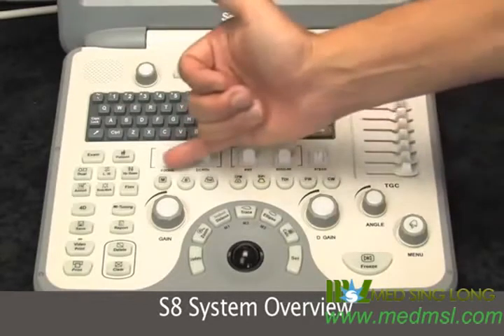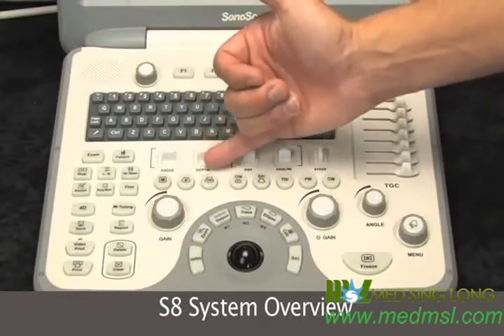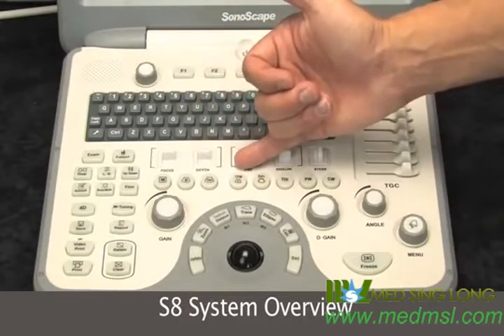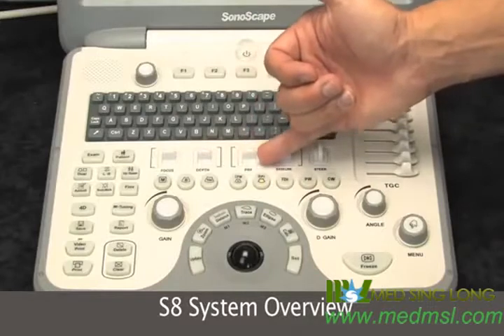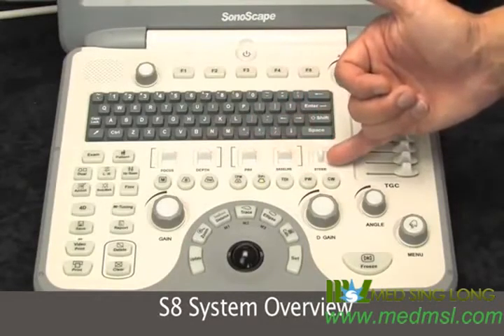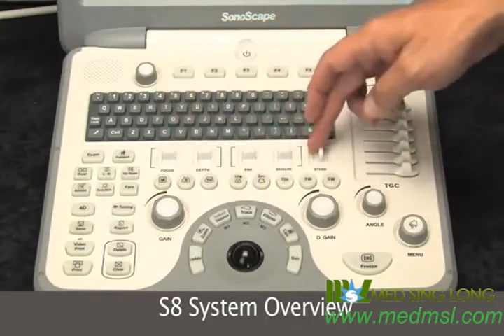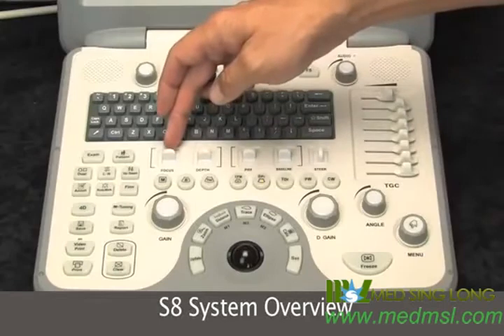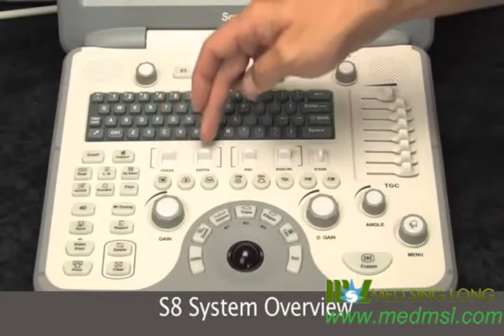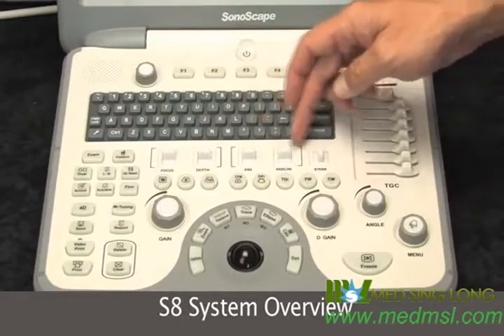Right above the main mode buttons: M-mode, B-mode, tissue harmonics, color flow mapping, Doppler power imaging, tissue Doppler imaging, pulse wave, continuous wave — we have the control buttons for those. Focus changes your focal zones on the system, depth, pulse repetition frequency, baseline, and steering for your Doppler.